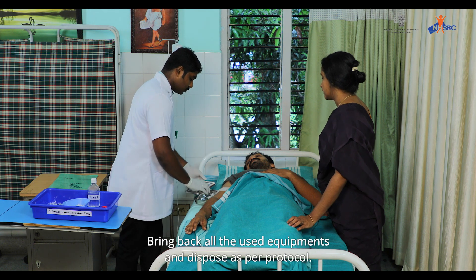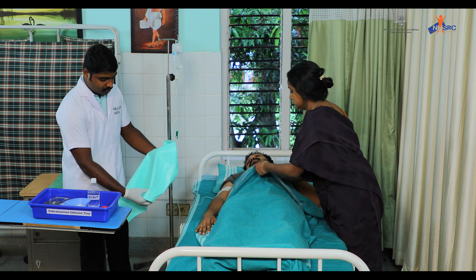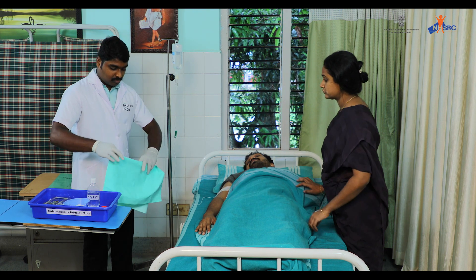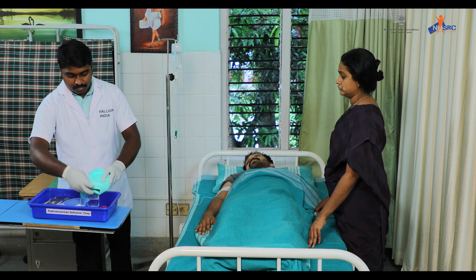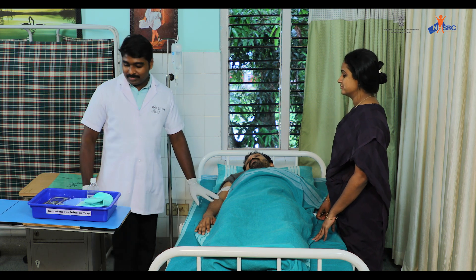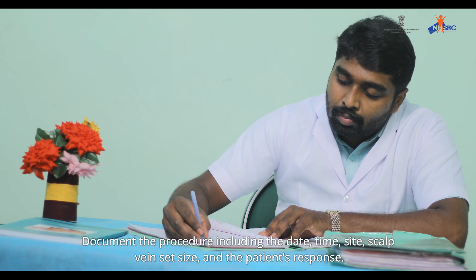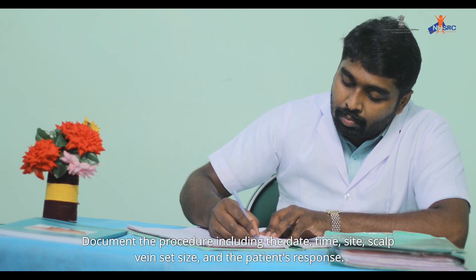Bring back all the used equipment and dispose as per protocol. Ensure the patient is comfortable. Document the procedure including the date, time, site, scalp vein set size, and the patient's response.